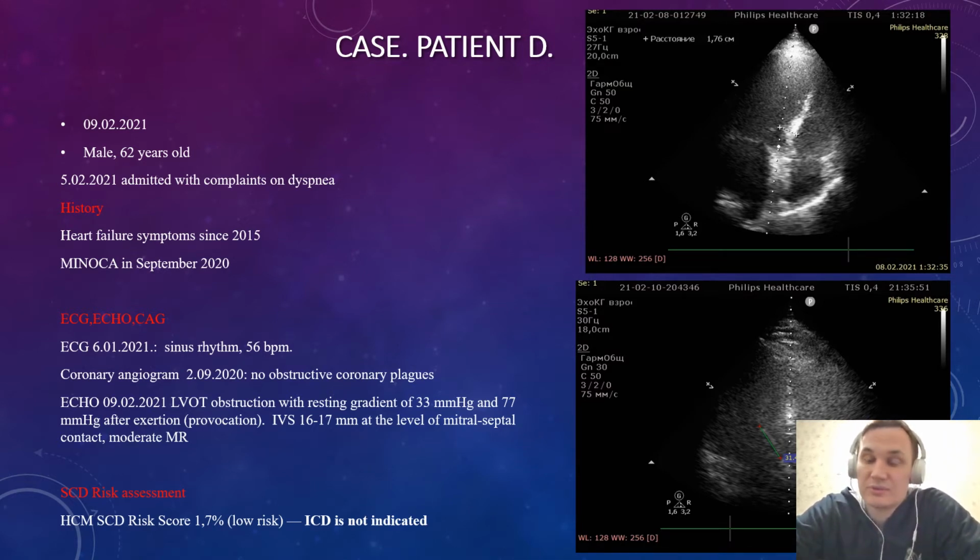we observed LVOT obstruction with a resting gradient of 33 millimeters mercury and 77 millimeters mercury after exertion. Generally we use physical exertion, 20 sit-ups, not pharmacological provocation, because Valsalva and pharmacological provocation in our experience were not so effective as a provocative agent.